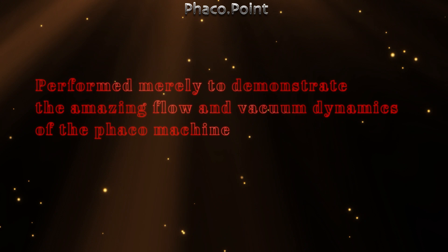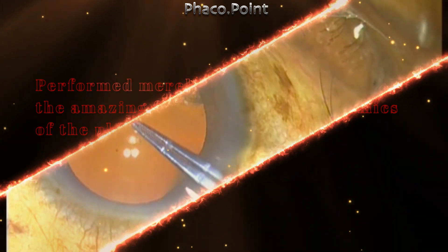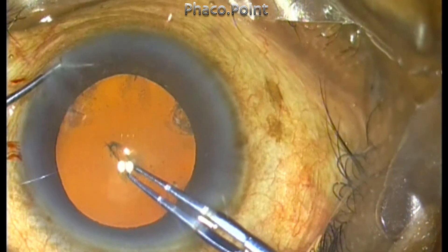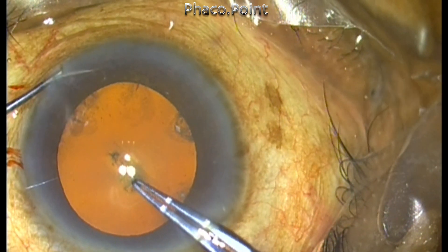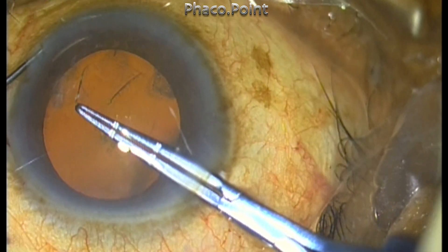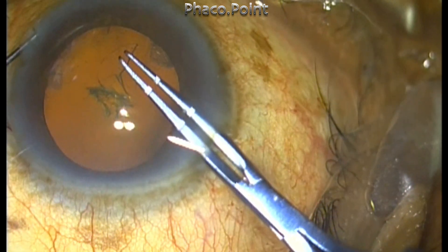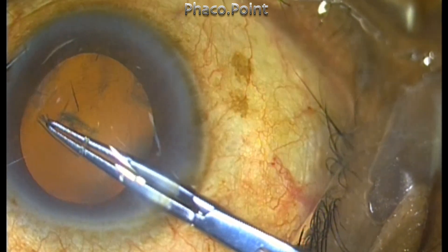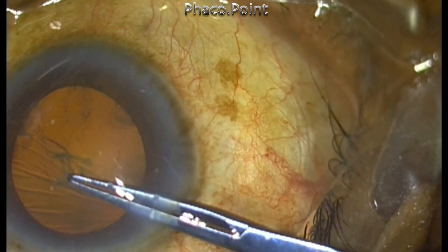I would definitely not encourage you to try this as a separate technique, but just to notice how things go and how you can use the flow and the vacuum simply to propel the pieces towards the FACO tip — to improve the followability and subsequently to remove the FACO pieces.